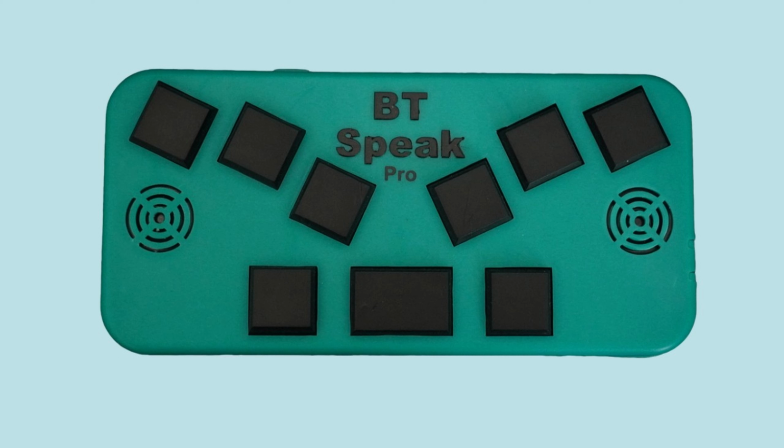I was just wondering, would there be a better speaker on the BT Braille 20 or 40, because the BT Speak speaker isn't really the best. Yeah, I can answer that. The BT Braille 40 has a much nicer speaker. We're still looking at the speakers for the BT Braille 20 to see if we can find something bigger that will fit. The BT Braille 20 doesn't have a whole lot more space for a speaker than the BT Speak does. But we are going to try. But the 40 has a much nicer speaker.